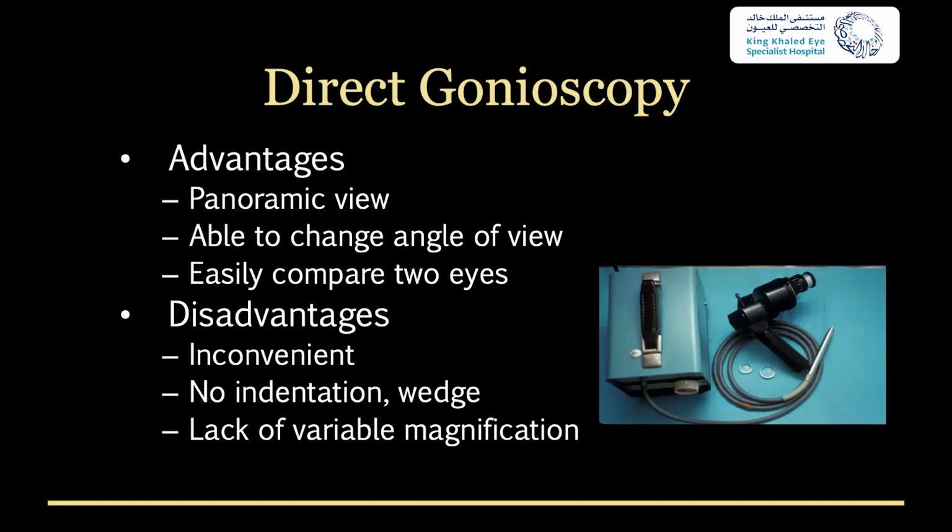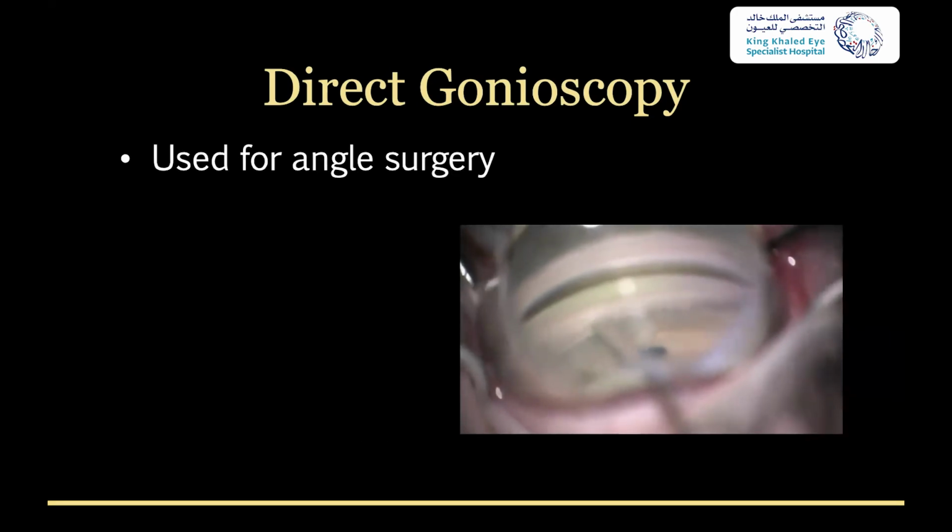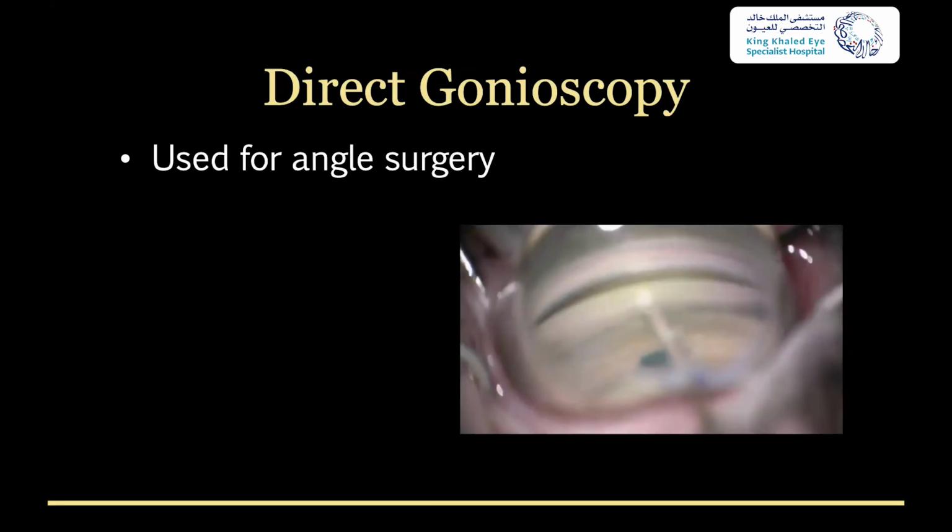You can compare the two eyes easily, but it's inconvenient. And as we all know, anything that's inconvenient, we tend not to do often. There's no indentation or corneal wedge, which are two tools that I'm going to talk to you about here in a minute. And you can't vary the magnification. But it's great for angle surgery. And this is me doing a goniotomy.